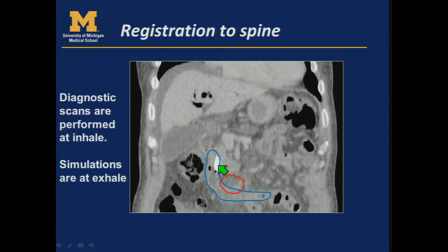And so instead of radiating the pancreas tumor up here, you're now radiating the duodenum instead and not treating the pancreas tumor. And this is very easy to do because the alignment is not intuitive necessarily, and you can't really see the pancreas tumor without contrast as a kind of logical double check that you're doing something right. So it's very important not to do this.